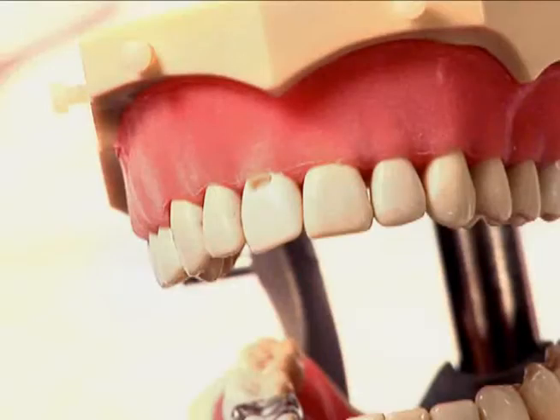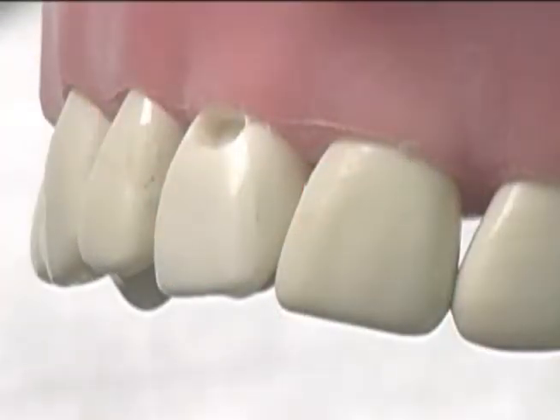We'll now reproduce a restoration on the facial of number 8, class 5, with composite. We begin again with the end in mind, which is a convex surface that will be smooth and confluent and aesthetic to the contours of the patient's original central incisor.